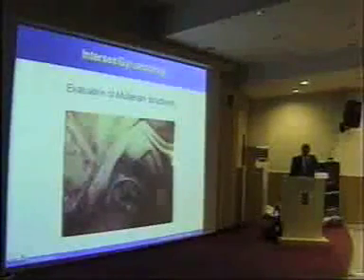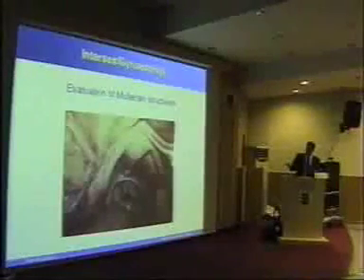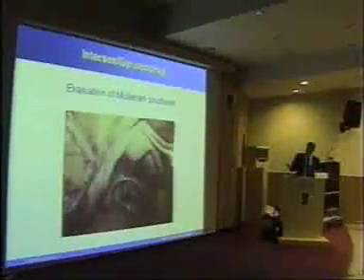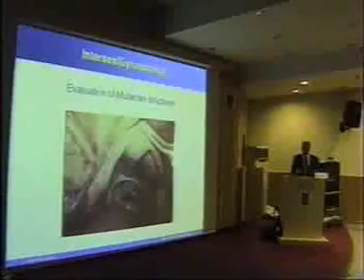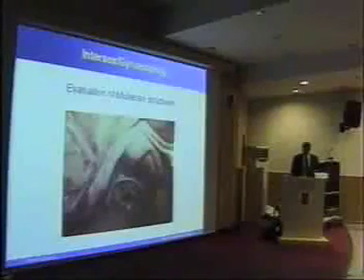You can look at the Müllerian structures if you're worried about an intersex child, you wonder what they've got inside. We're looking down into the rectum is here. This is actually a normal-looking cervix, uterus, and fallopian tubes and an ovary here in a girl. But sometimes you need to make sure, because your ultrasound can't tell you, your various other modalities of scanning can't tell you, you've got to make sure that you can get the diagnosis.